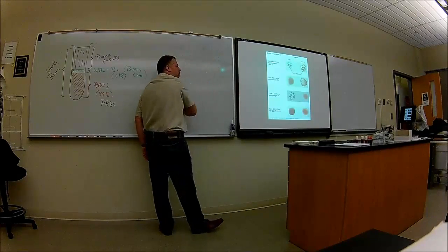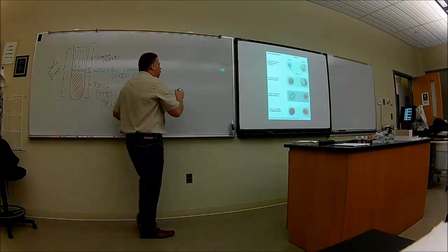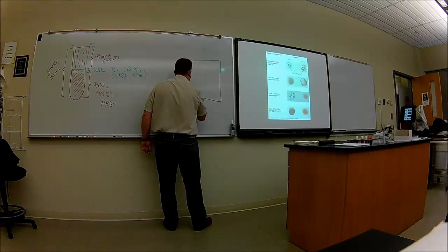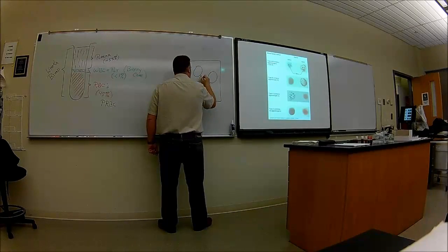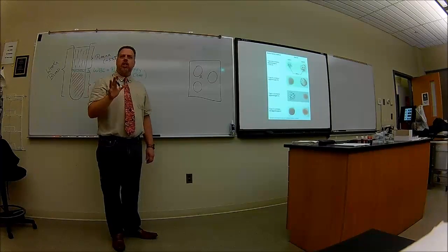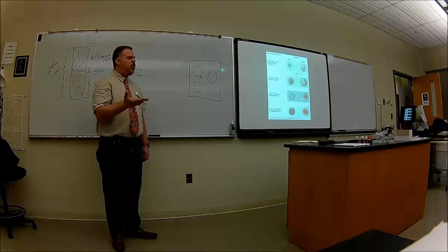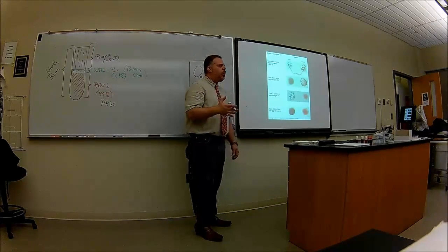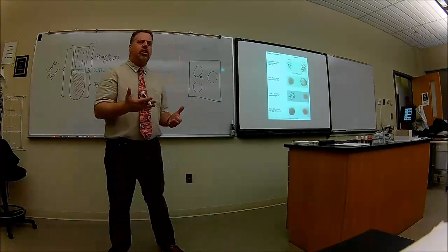let's talk about the experiment today, and then we'll do RH and I'll let you guys loose. There's a tray in front of you that kind of looks like this. Have everyone grab one so you know what I'm talking about, okay? Now you're going to see some changes in here. We're going to put some liquids in here, and it's better to see the changes under a white piece of paper. If you have a white piece of paper or something that even has words, it'll become blurry. We're not going to do it just yet, but just to get prepared. The black tops on here, you just can't see those changes properly.